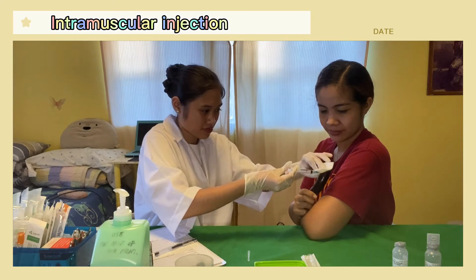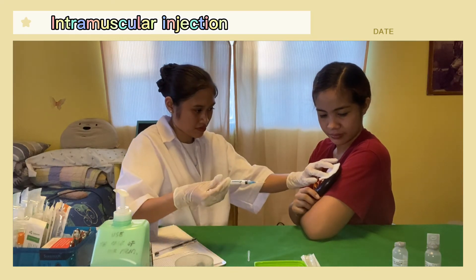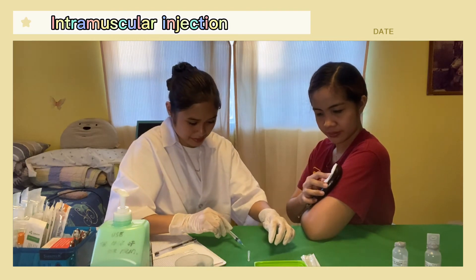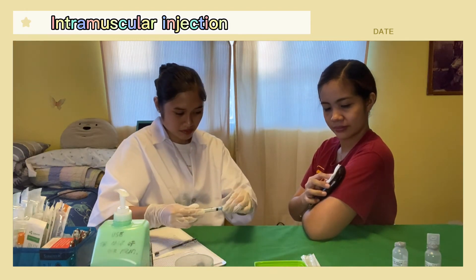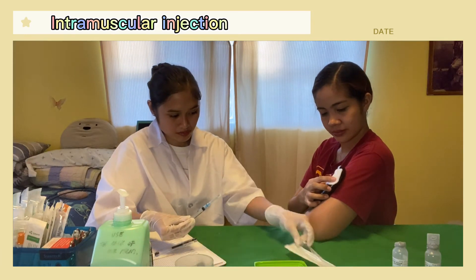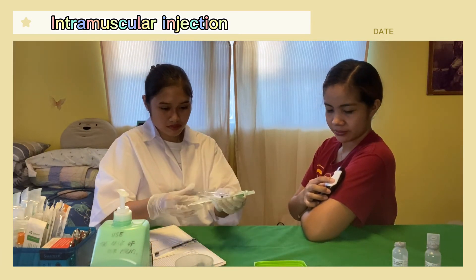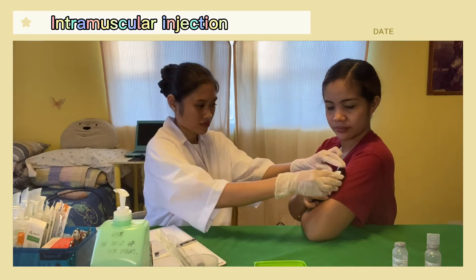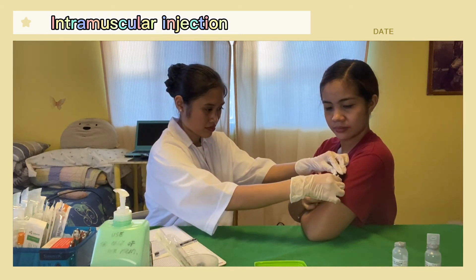Quickly withdraw the needle while applying pressure with an antiseptic swab. Dispose the syringe used and put it in the biohazard box. Now, gently massage the injection site.